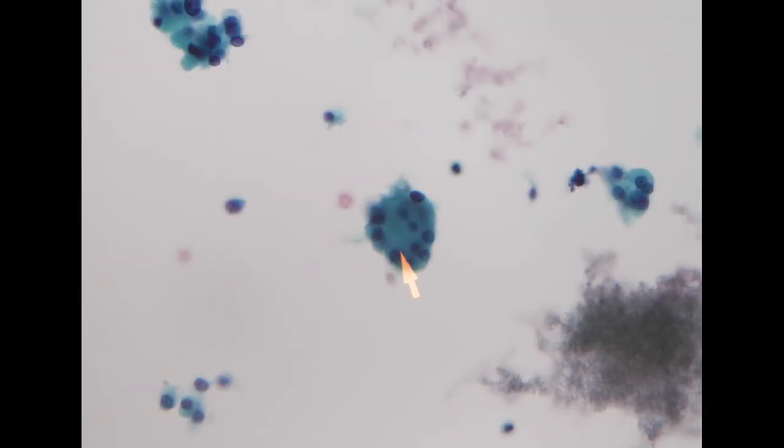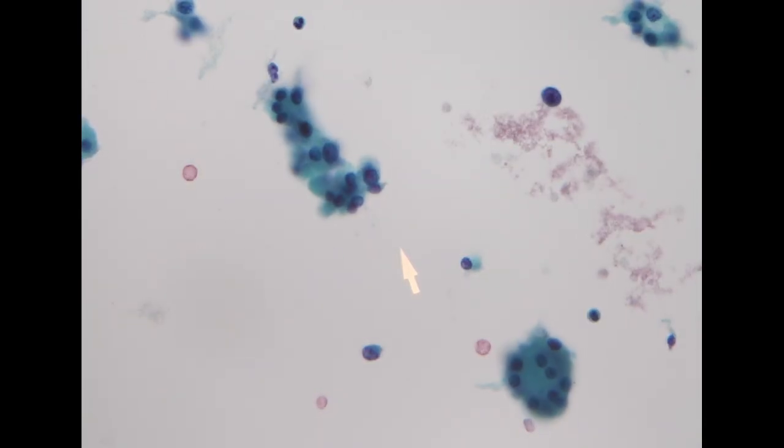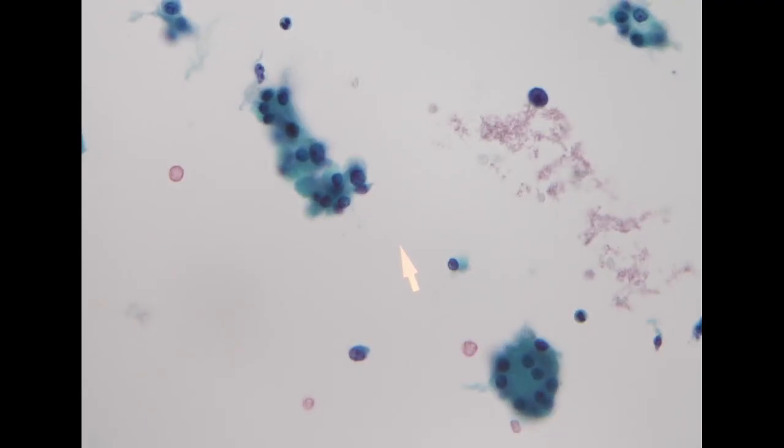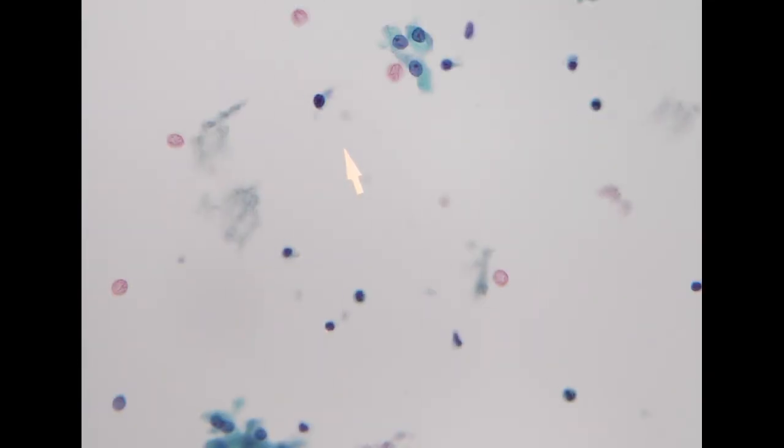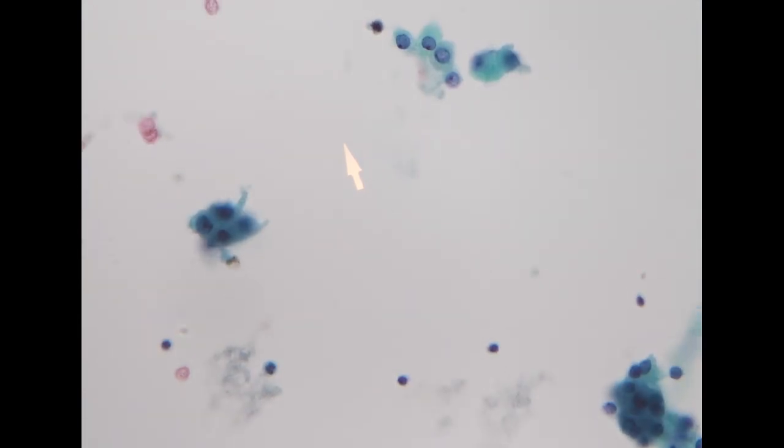On higher power, these cells have enlarged nuclei and distinct nucleoli, and also quite abundant granular cyanophilic cytoplasm. So these cell components are actually oncocytes or Hürthle cells.